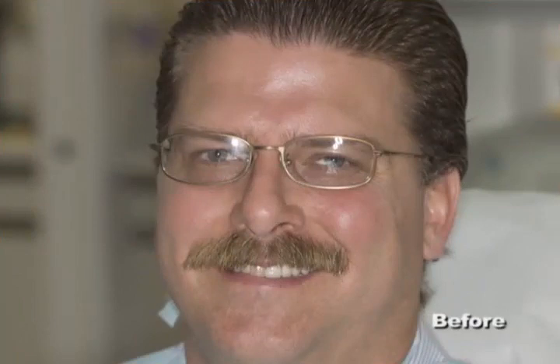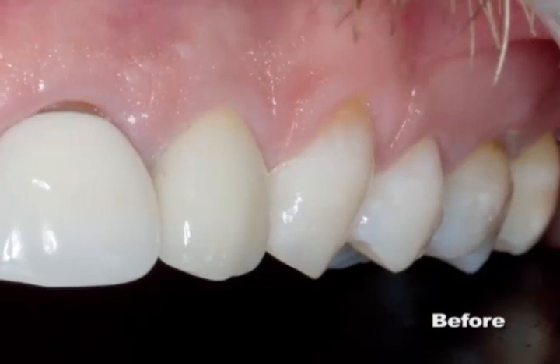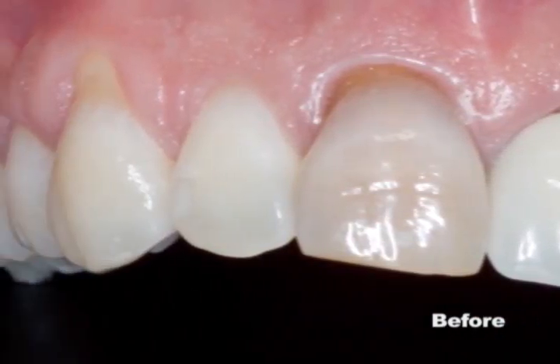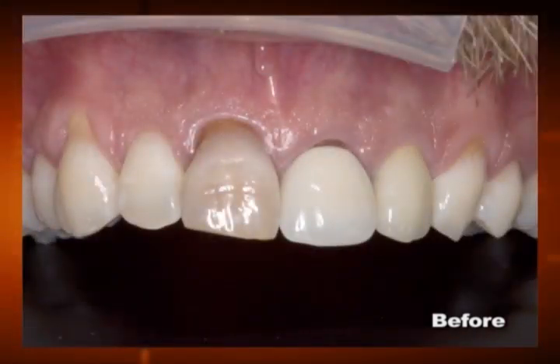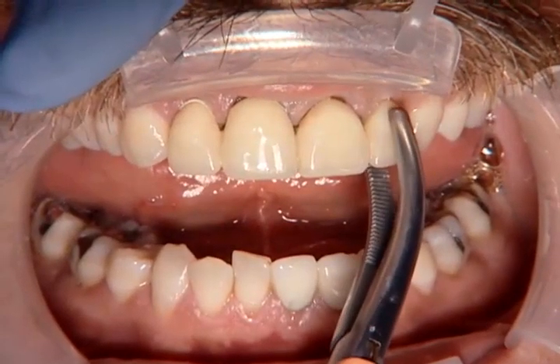On this patient, we're going to use a combination of clinical zirconia, CZ crowns, and no prep veneers. As you can see, tooth number 8 has had endodontic treatment and is very dark. Tooth number 9 has had endodontic treatment as well and has an old PFM on there, and you can see the dark surface of the root showing through because of a short margin. There's some other issues going on too, some old composites on teeth number 7 and 10. So what we're going to do for this patient is CZ crowns on teeth 7, 8, 9, and 10, single unit crowns, and then round off the smile with some no prep veneers.